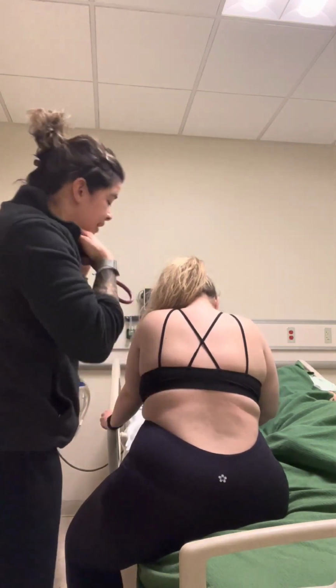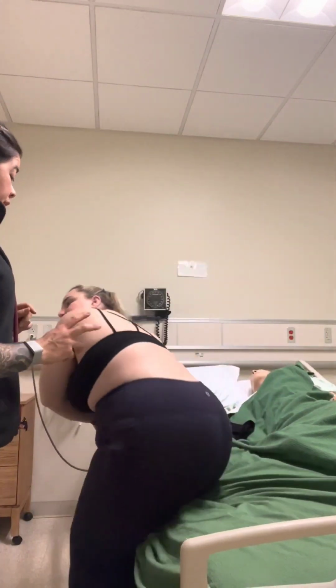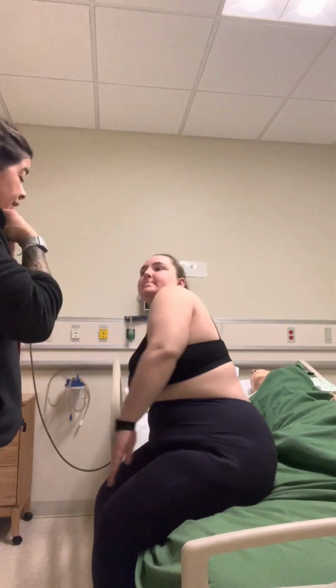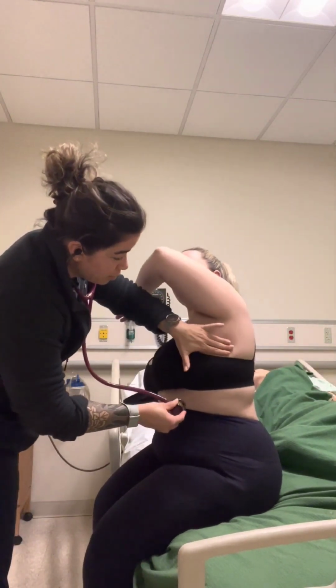Okay. So anterior and posterior lungs sound good. Your heart sounds good. Now I'm just going to go ahead and take a listen to underneath your sides, your arms. So we'll listen to this side first.